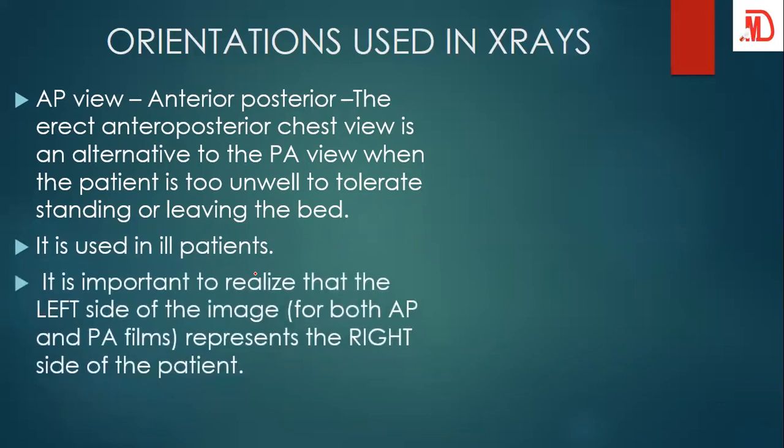Now, it is important to note that the left side of the image, when you are looking at it, for both AP and PA films represents the right side of the patient. Very important thing you need to note. So when you are looking at the film or the image, your left side is the patient's right side, and the same applies to the opposite side. Your right side is the patient's left side. I believe this is fundamental and you get it.